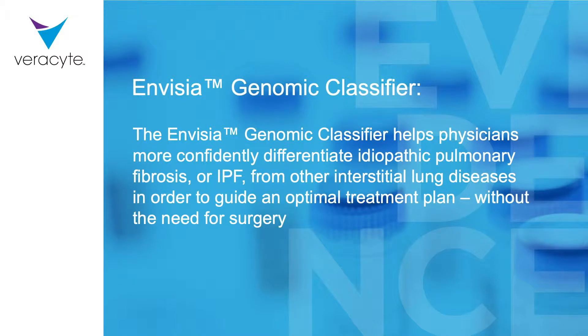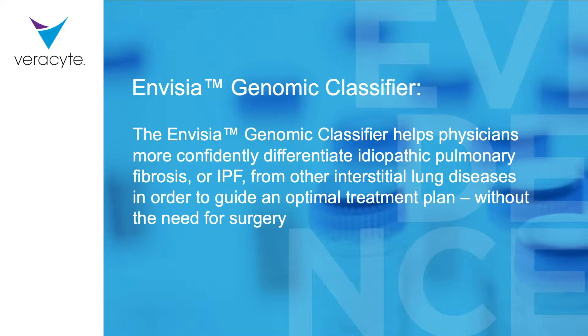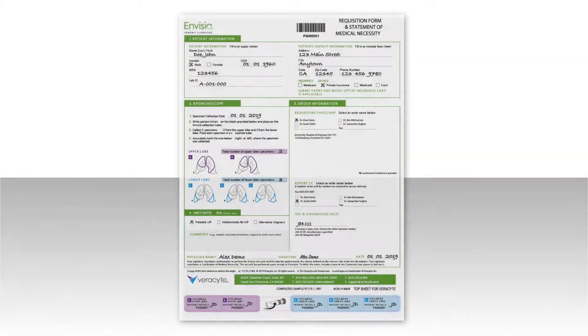The Envisia Genomic Classifier helps physicians more confidently differentiate idiopathic pulmonary fibrosis, or IPF, from other interstitial lung diseases in order to guide an optimal treatment plan without the need for surgery. Here's how to use it.